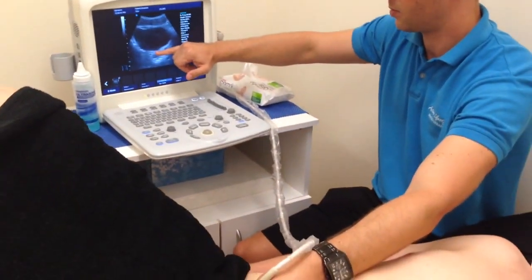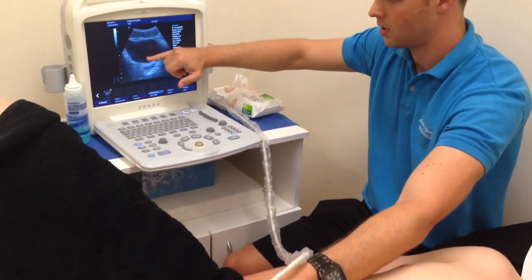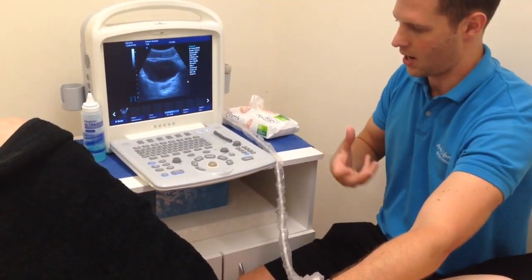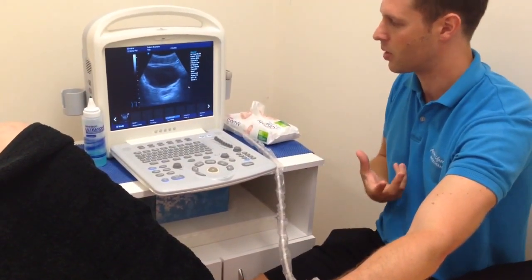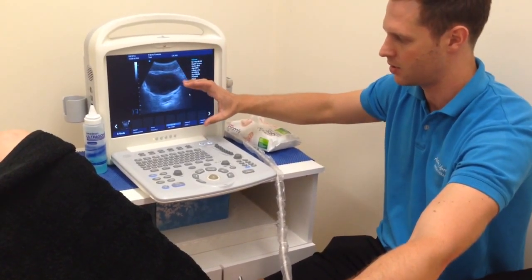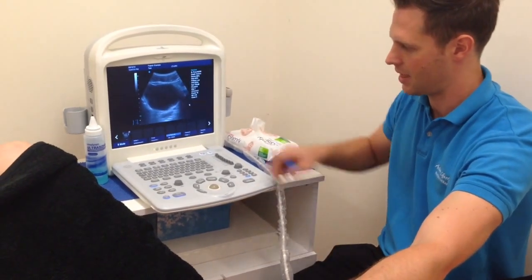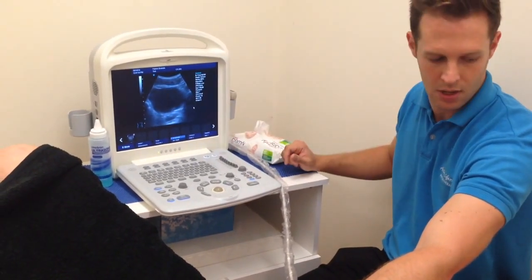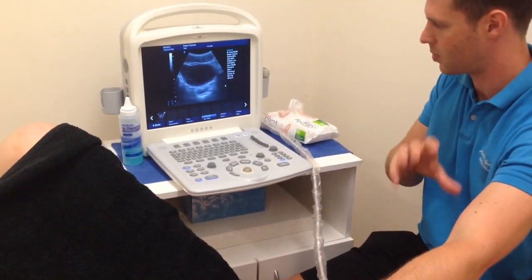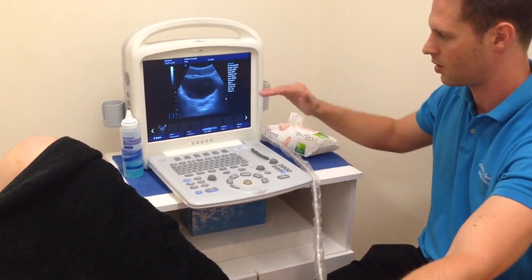What we're seeing there is the bladder actually raising up. For most people it will normally fall, because there's basically increased pressure on the pelvic floor, which usually causes the bladder to go down in the image. The other thing I'll get you to do is just a Valsalva manoeuvre. That's what often happens with people when they do a straight leg raise — your core and your pelvic floor in particular seem to be doing a very good job of stabilising.